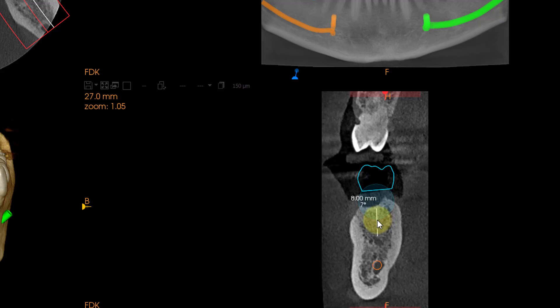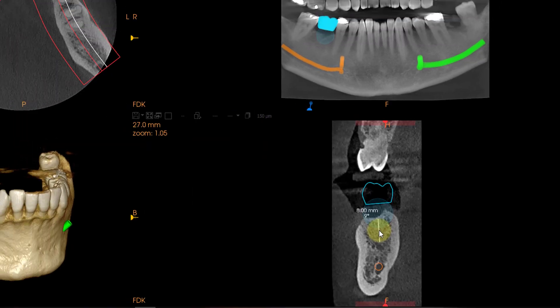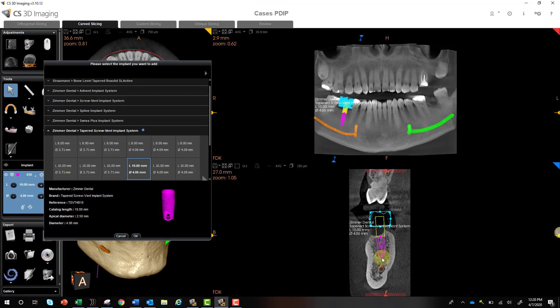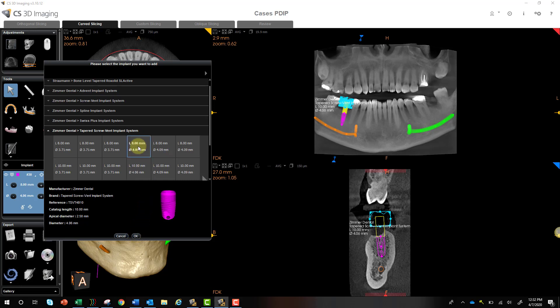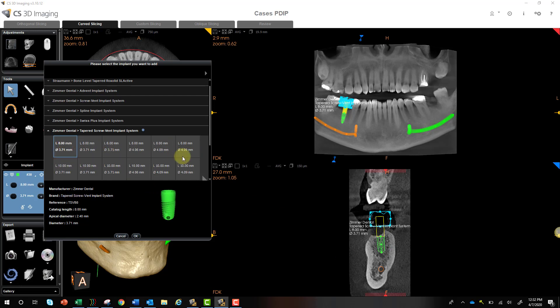After your first click, you'll also see the degrees of angle compared to where you have your crown placed. When you click a second time, it opens up your favorites window showing which implant system you're using — in this case, the tapered screw vent for Zimmer — and it recommends the best option based on that length measurement. As you select each implant, you can watch the cross-sectional view in the lower right change on the fly so you can visualize your plan.